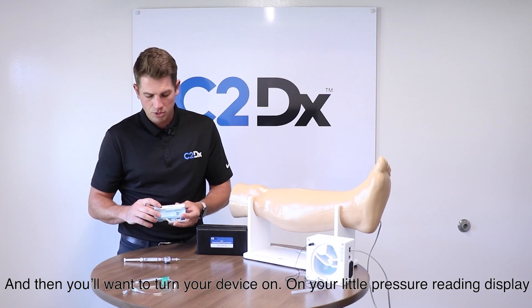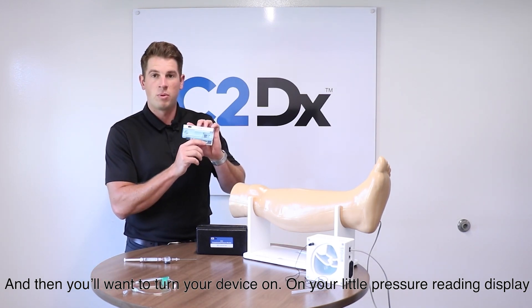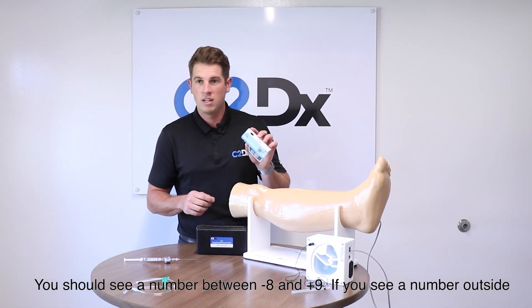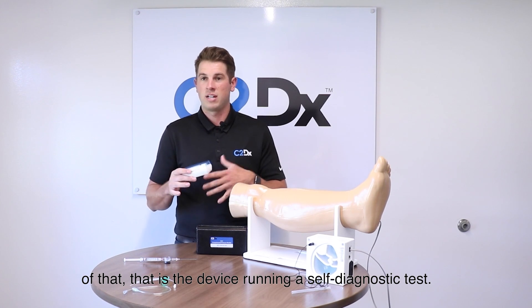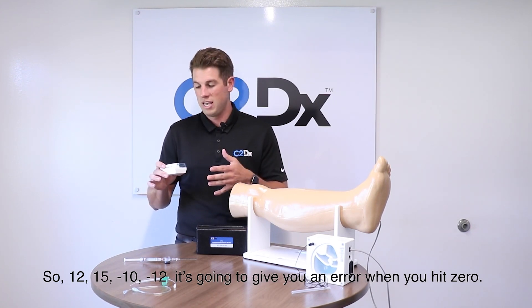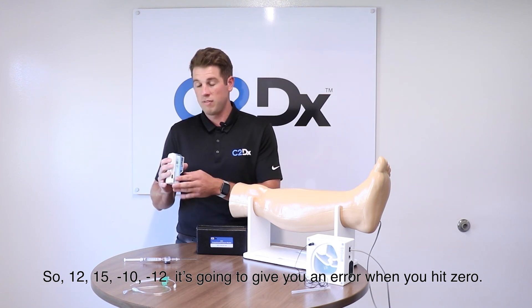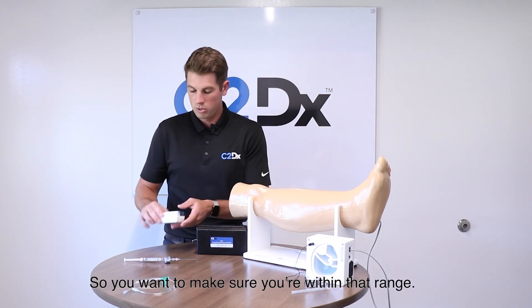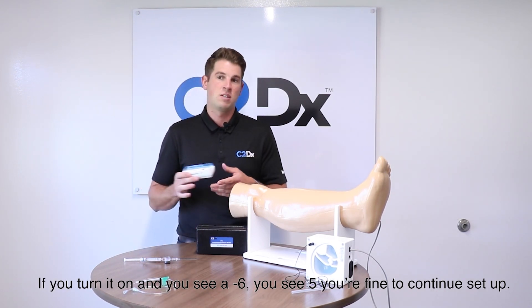Turn your device on. On the pressure reading display you should see a number between negative eight and positive nine. If you see a number outside of that range, the device is running a self-diagnostic test — for example, 12, 15, negative 10, or negative 12 — and it will give you an error when you hit zero; it won't be able to reach zero. So make sure you're within that range before continuing.